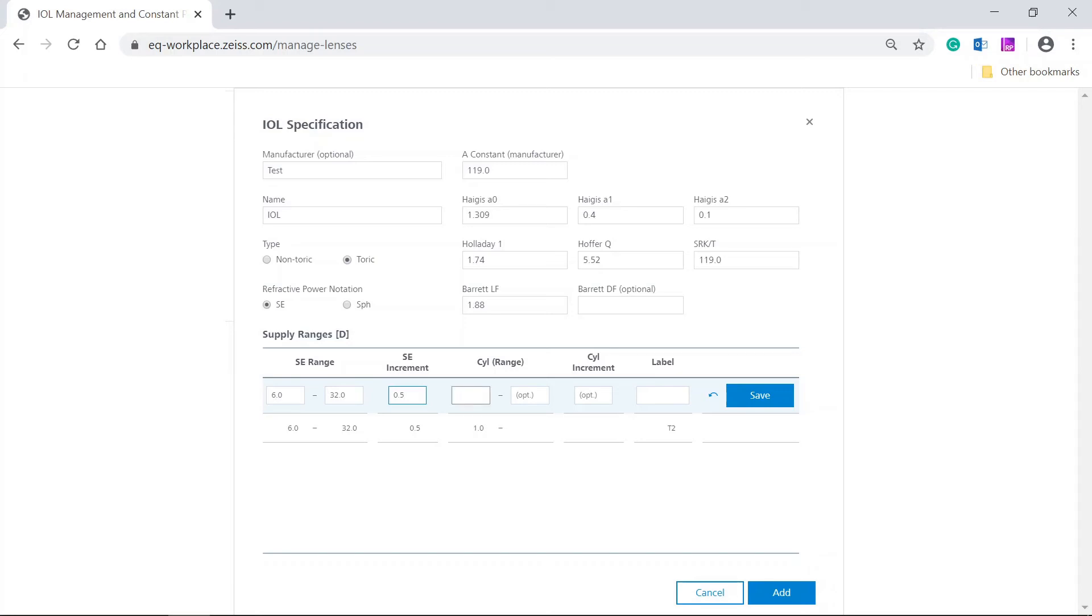Enter the second cylinder, for example, 1.5. In the label field, type in the name, for example, T3 and click on save.